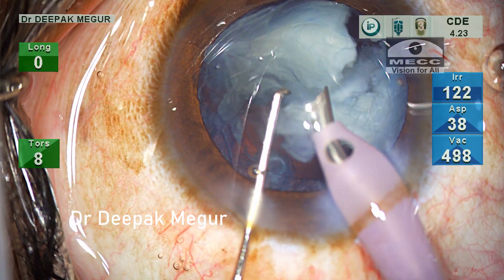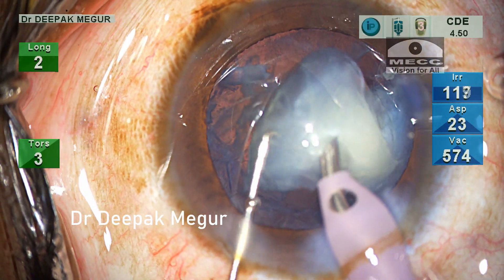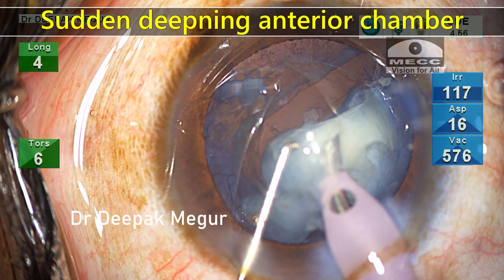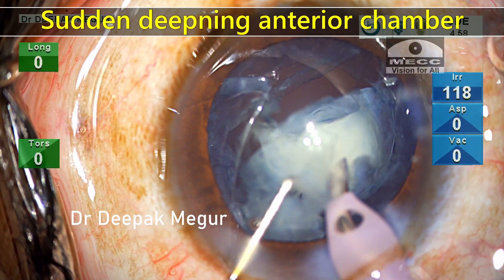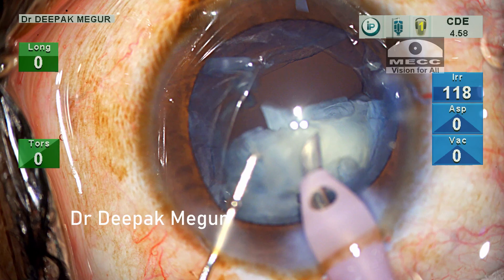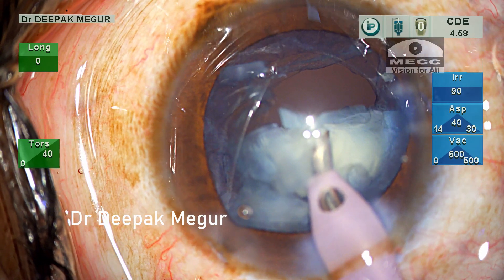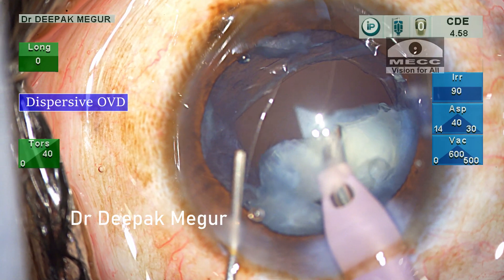The next fragment is emulsified — now just two more fragments are remaining. As I am trying to emulsify this fragment, suddenly there is a deepening of the anterior chamber, which is probably indicative of rupture of the anterior hyaloid face. As a rule, I need to remember to put in OVD before pulling out my phaco probe. The dispersive OVD acts like a temporary barrier, tamponates, and can potentially prevent vitreous prolapse.